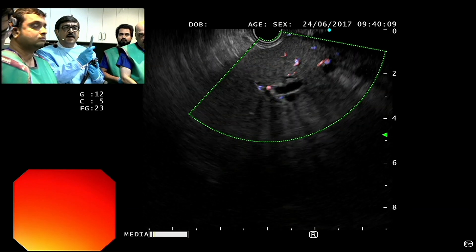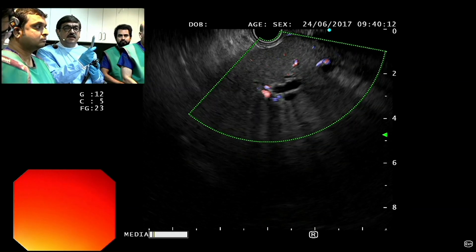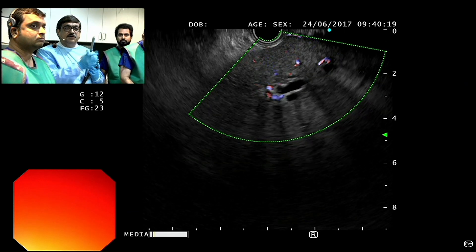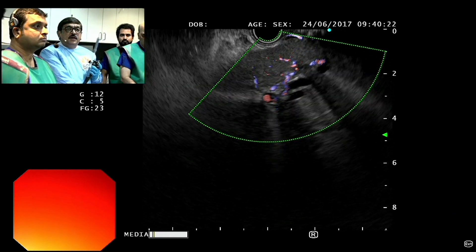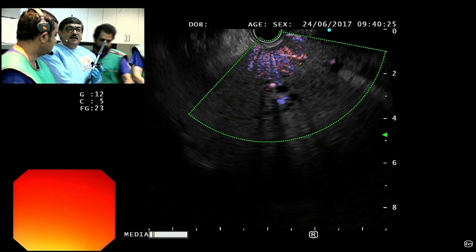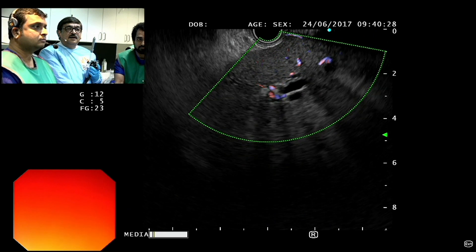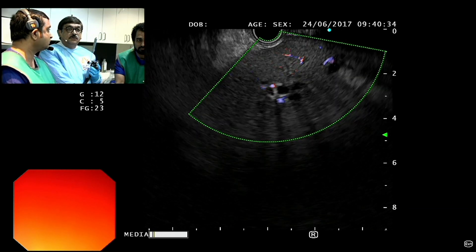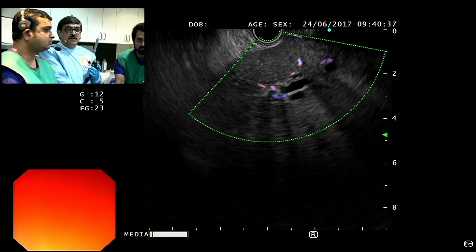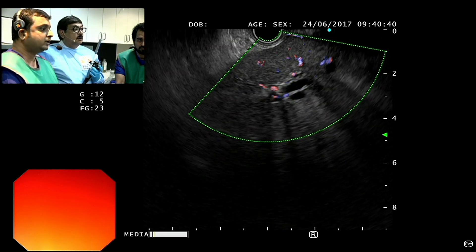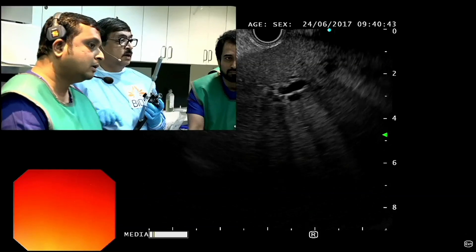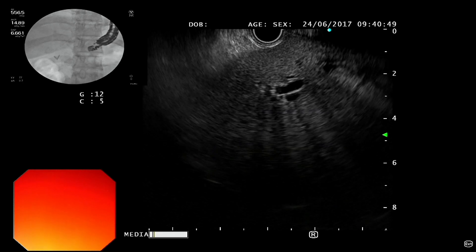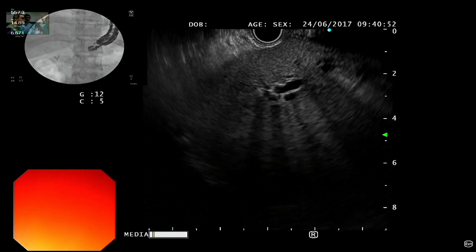You can see that mildly dilated biliary radical in the center — that is what I am going to approach and try to go into. I am trying to get a good position where there are not many vessels in the way. The endoscope is at the gastro-esophageal junction, about a centimeter or two beyond it. If you see the fluoro, you will see the position of the scope — it is just beyond the GE junction, bent a little upward, so I am probably accessing a segment 3 radical.